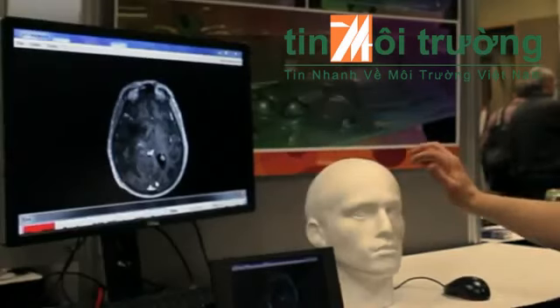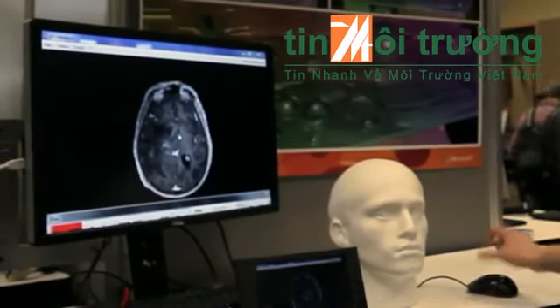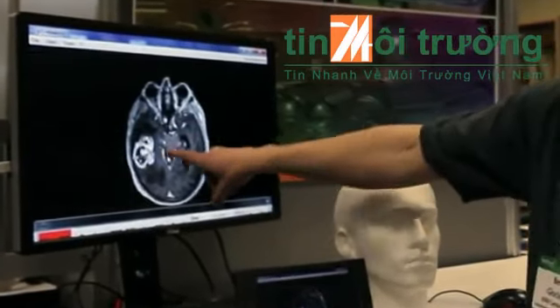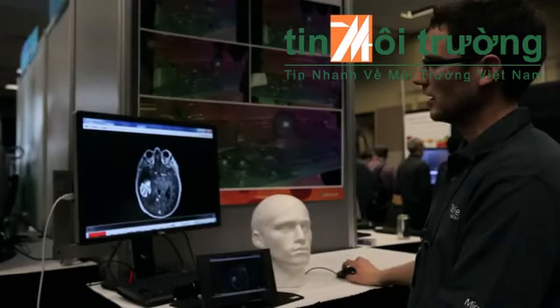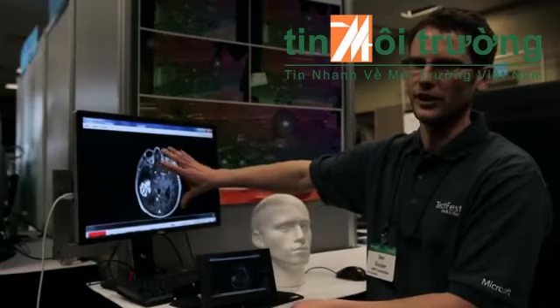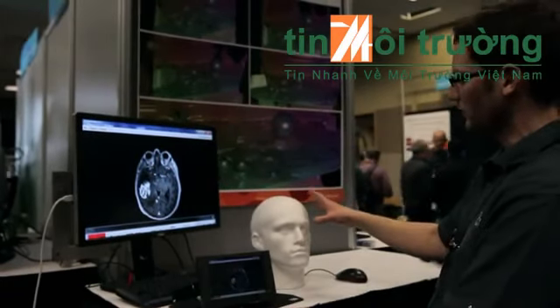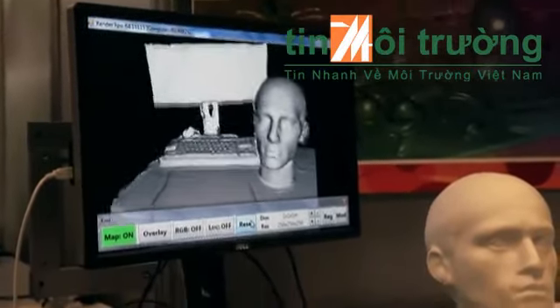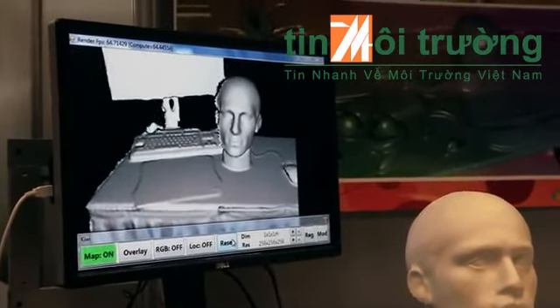The problem is that the scan that I usually take for diagnosis and surgical planning, where, for instance, here I see a tumor that I want to resect from the brain during the surgery. The problem is always, how do I get this information, which is 2D and on a screen mounted on the wall, for instance, how do I get this information into the operating theater and basically in situ on the object that I want to perform the surgery on?